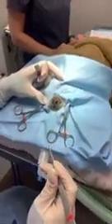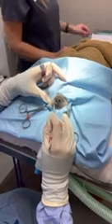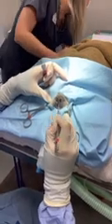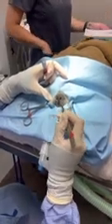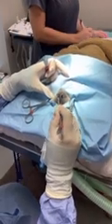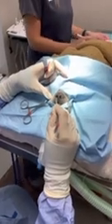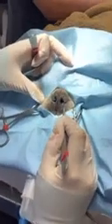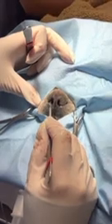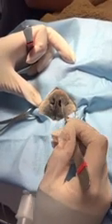Today we're doing a stenotic nares repair — basically this nostril is too narrow on both sides. It happens in certain breeds, most common in brachycephalic breeds like bulldogs. This is a French bulldog we're working on today. It's just too tight, and you can see how widening this nose hole helps them breathe a lot easier. I tell clients breathing through these narrow nose holes is kind of like you trying to run upstairs breathing through a straw.